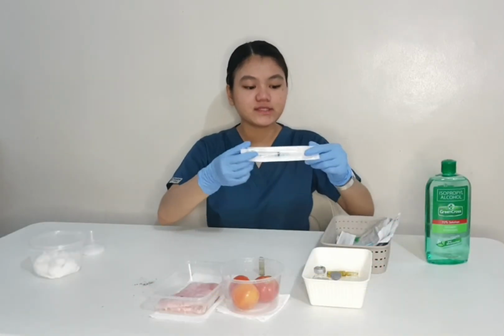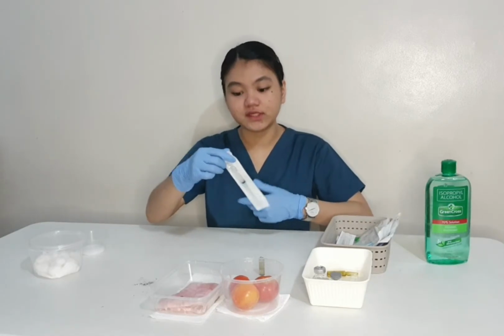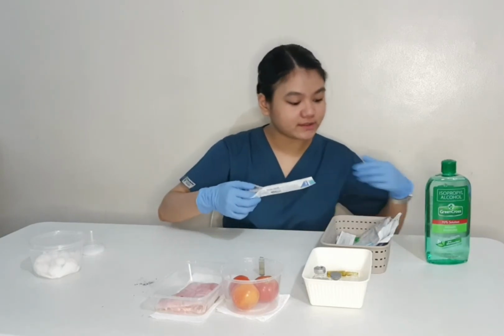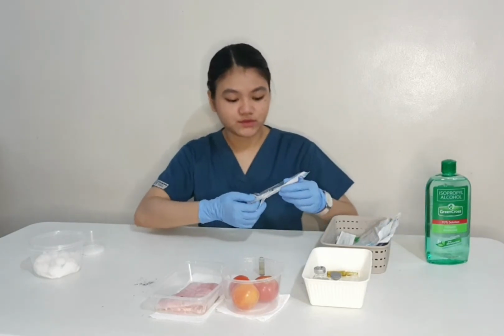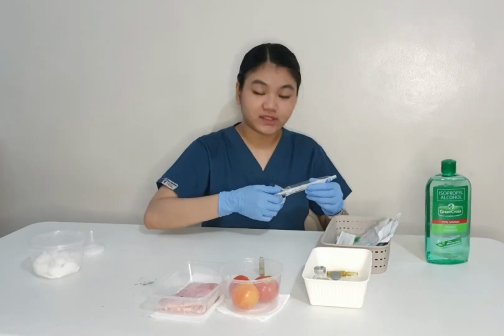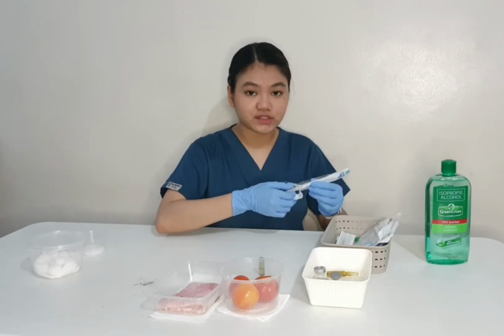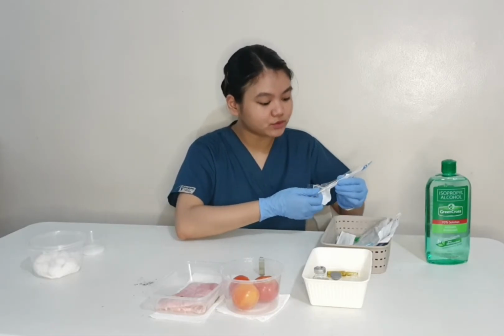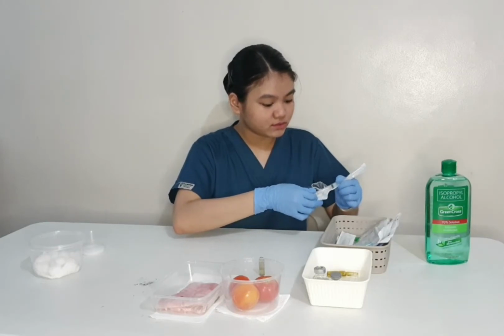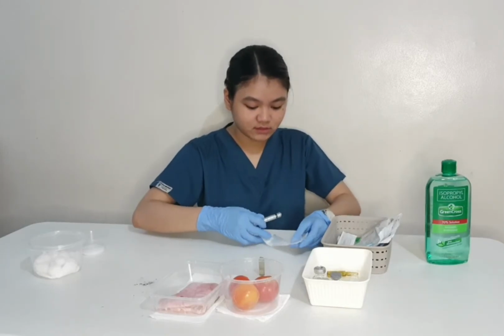My 3cc syringe actually has a 23 gauge needle, and therefore we have to change it to a 19 gauge needle. To prevent contamination of the needle, we must not touch the needle, and we have to change the needle in here. There you go, we can twist it, and then there.